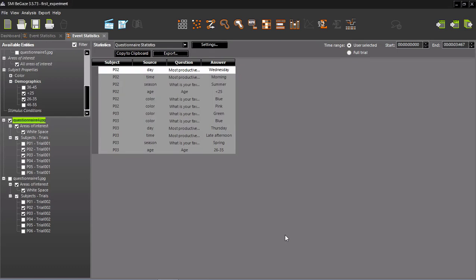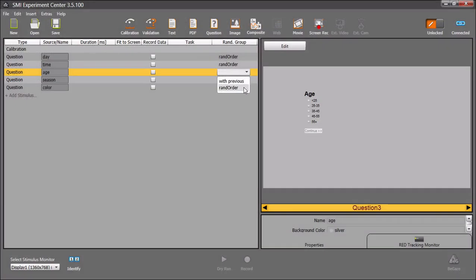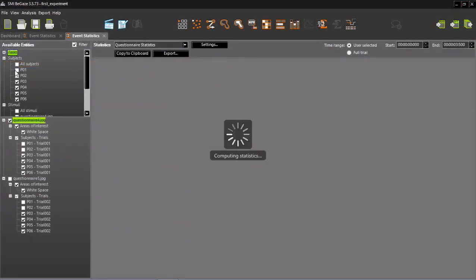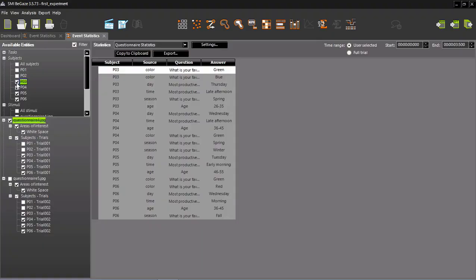Creating a quiz is pretty easy. The Experiment Center gives you a lot of options for doing this quickly. After you master a few features like randomizing, organizing, and grouping your results, you'll be able to create meaningful tests that will help you capture better results from your sessions.